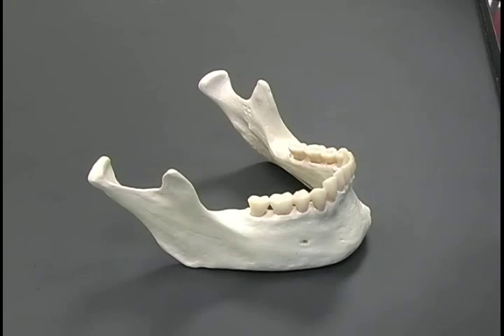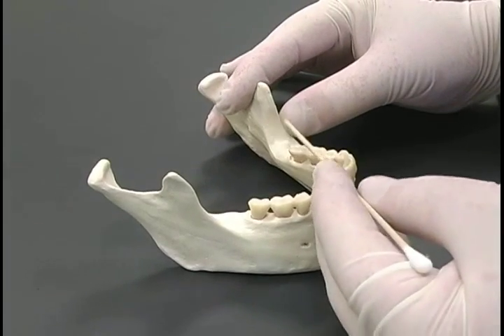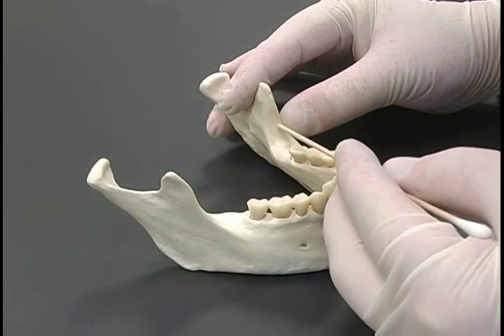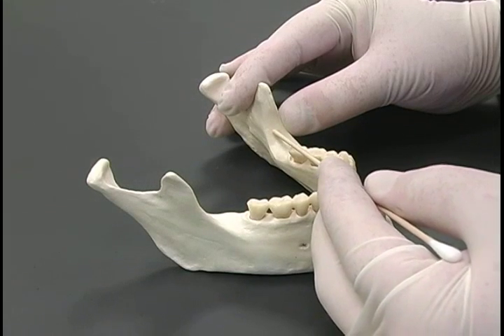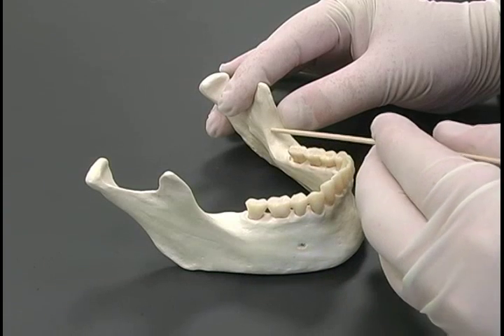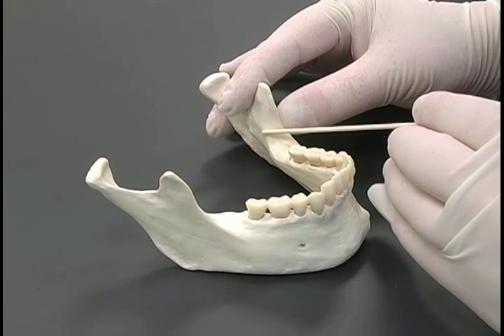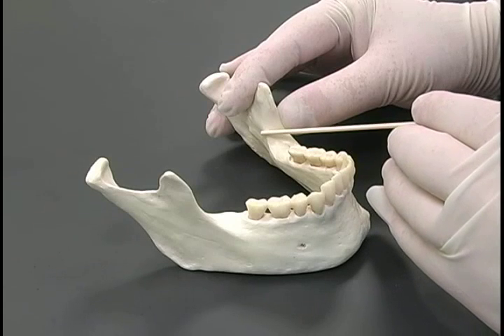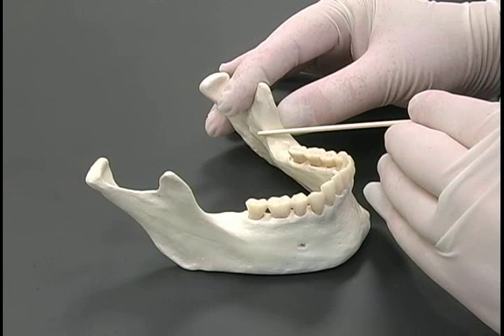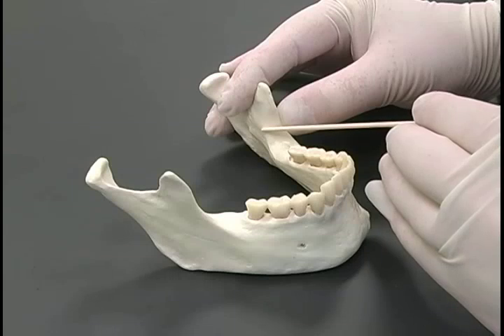Sometimes, in certain patients, the anatomy of this region is such that the mandibular ramus may be quite wide, so going five millimeters medial to the external oblique ridge means that you need to move all the way over to navigate past the internal oblique ridge. Sometimes you will need to bend the needle a little bit to achieve passing the internal oblique ridge.